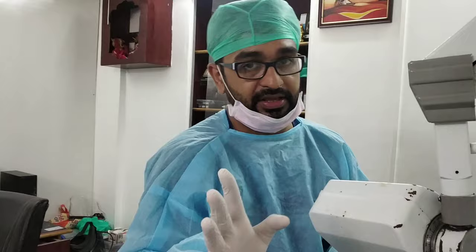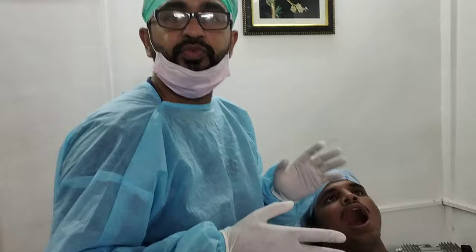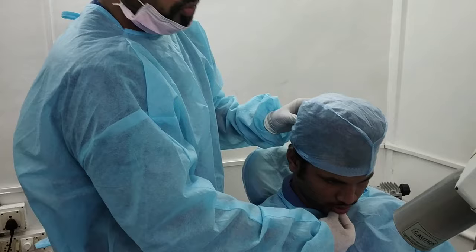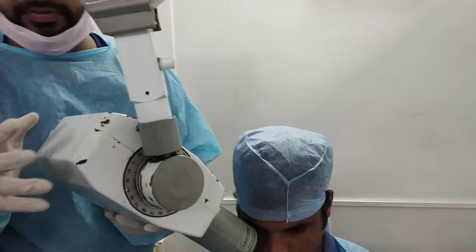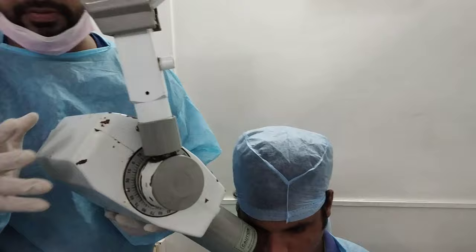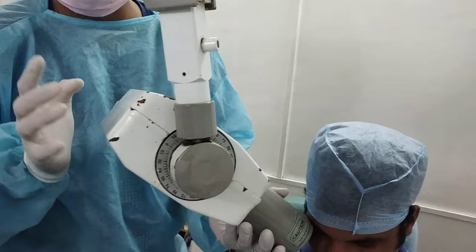If we want to take the x-ray of the canine — both mandibular canine and maxillary canine — it is very tricky, because the canine root is always long, sometimes even 28 millimeters. We have to assess the palate of the patient, whether it is a high arch palate or a shallow arch palate. In patients with a shallow arch palate, we need to tip the head more downwards and give more positive angulation. For the anterior teeth we give around 45 to 50 degrees, but for the canine we need approximately 60 to 65 degrees. You tell the patient to look downwards towards their legs and then position the cone accordingly. Mind it — the canine is very tricky. Sometimes using IOPA you will see either the crown has been cut or the periapical area has been cut. You can also place the IOPA film slightly tilted — that is another technique for the upper canine.